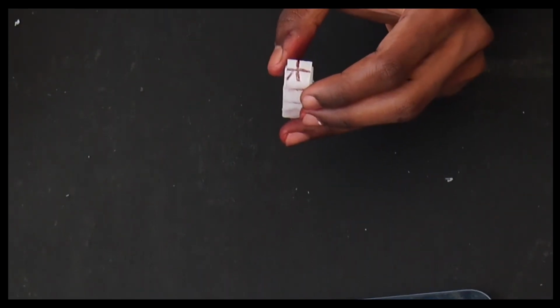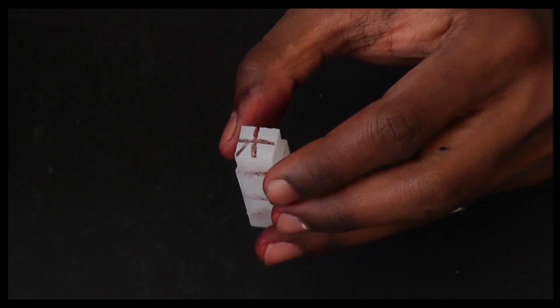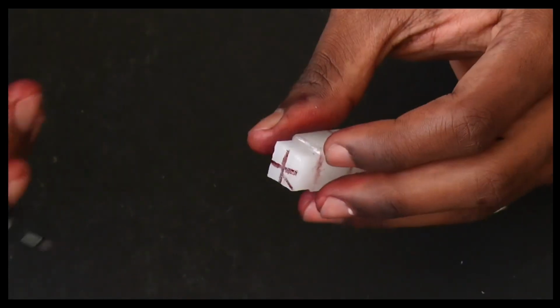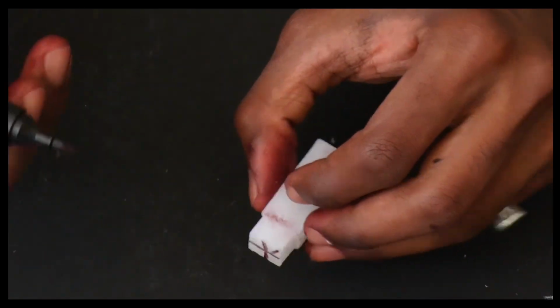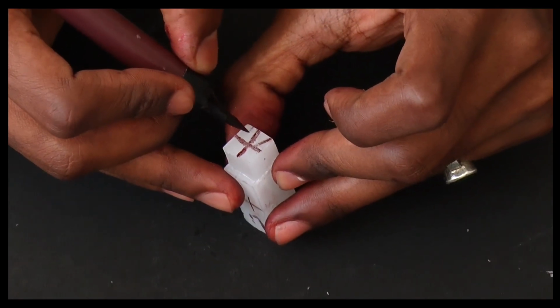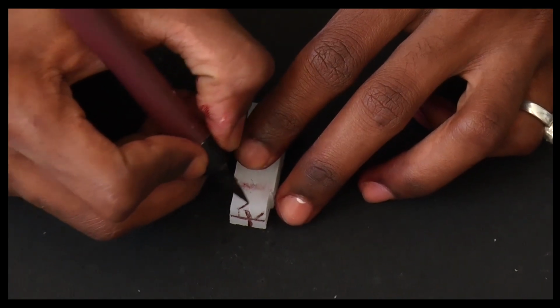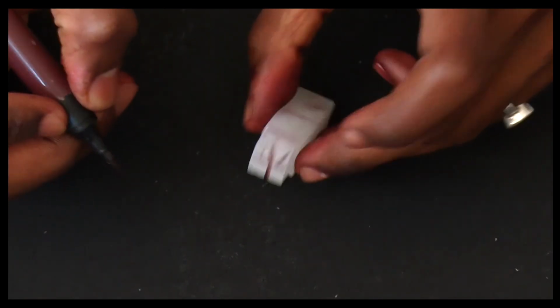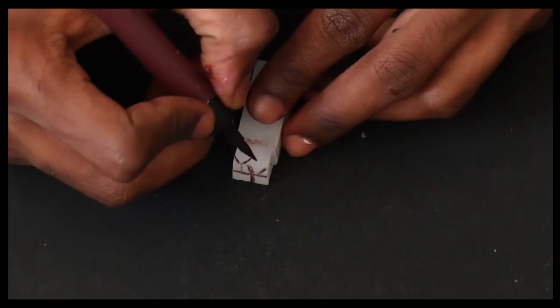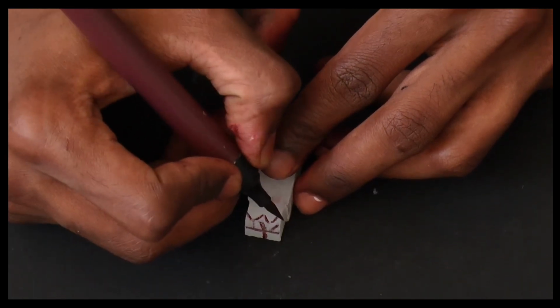Now, after having compartmentalized this, we need to do the same triangles which we did in our previous molar, the maxillary first molar, where you draw a center for every cusp and then draw the triangle at that cusp. Draw one triangle here, and there are 3 triangles coming here, one here, another here, and another here.